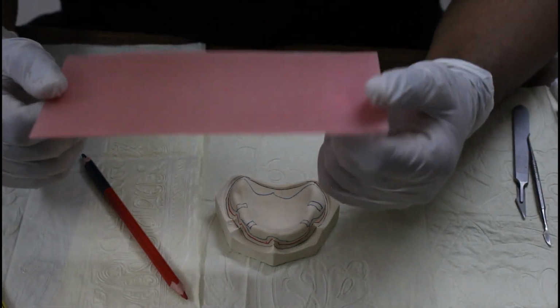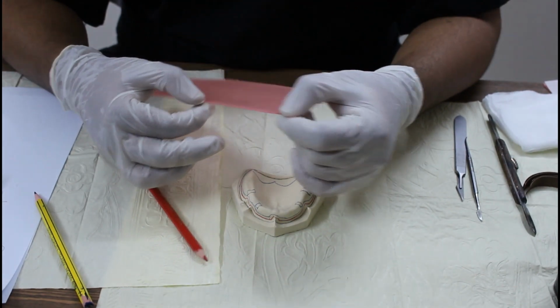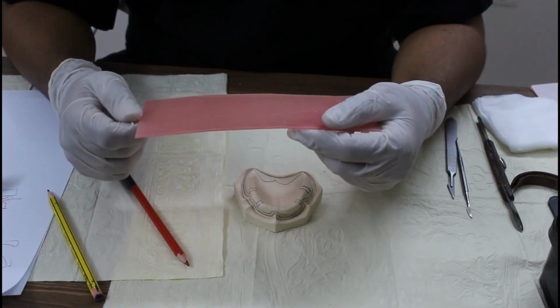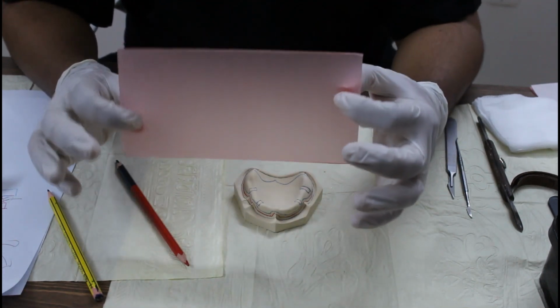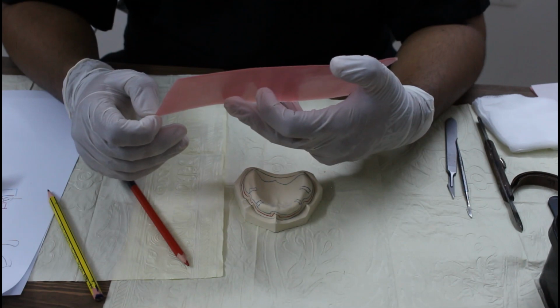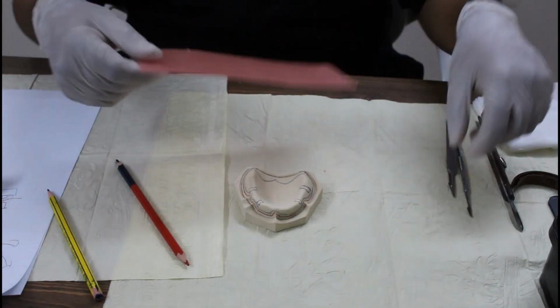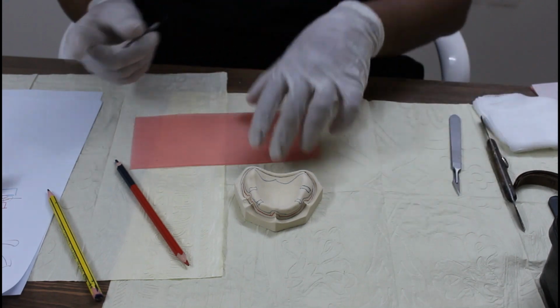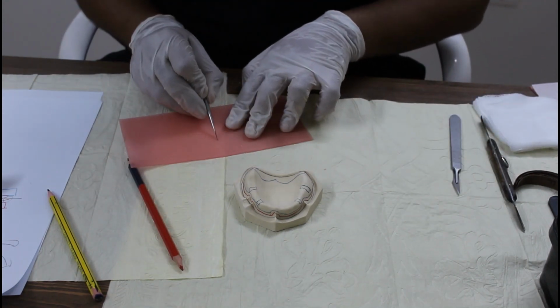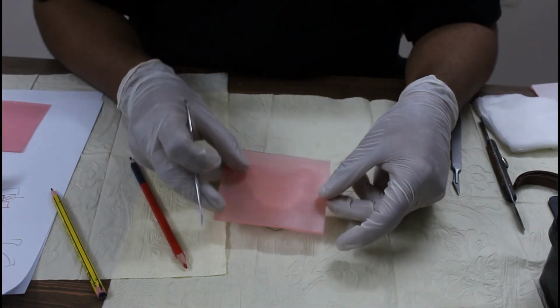This is a modeling wax sheet. This is 1.5 to 2 millimeters. The one available in our college is 1.5 millimeter. Now this wax sheet will act like a spacer, means it will provide space for the impression material. So take your wax sheet, cut it half. Half wax sheet is enough for one.